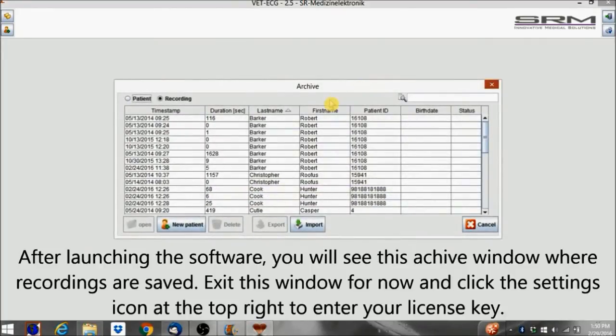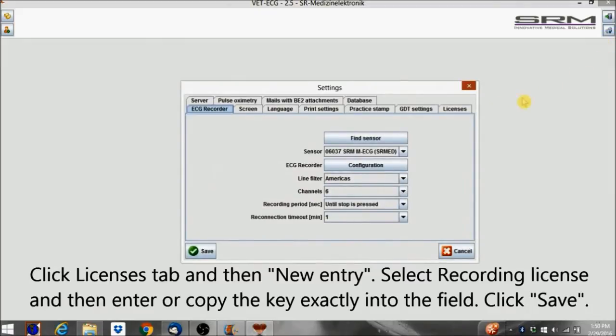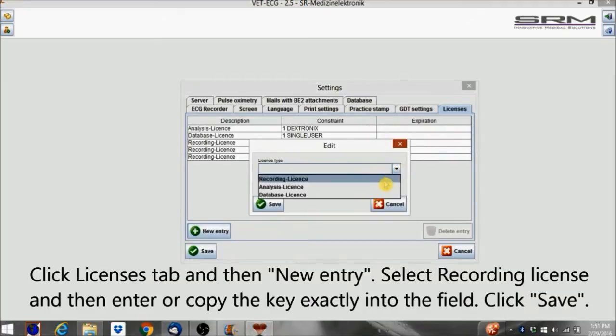After launching the software, you'll see the archive window where recordings are saved. Exit this window for now and click the Settings icon at the top right to enter your license key. Click the Licenses tab and then New Entry. Select Recording License, then enter or copy the key exactly into the field and click Save.